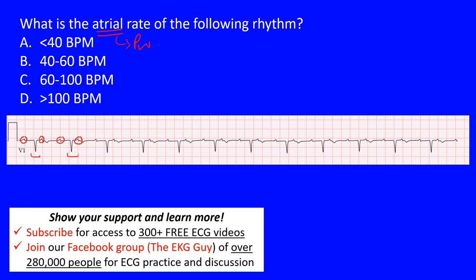Counting the P waves across the strip: we have four already, then continuing — five, six, seven, eight, nine, ten, eleven, twelve, thirteen, fourteen, fifteen, sixteen, seventeen, eighteen, nineteen, twenty, twenty-one, twenty-two, twenty-three, twenty-four, and there's one at the end — twenty-five. So we have a total of 25 P waves.